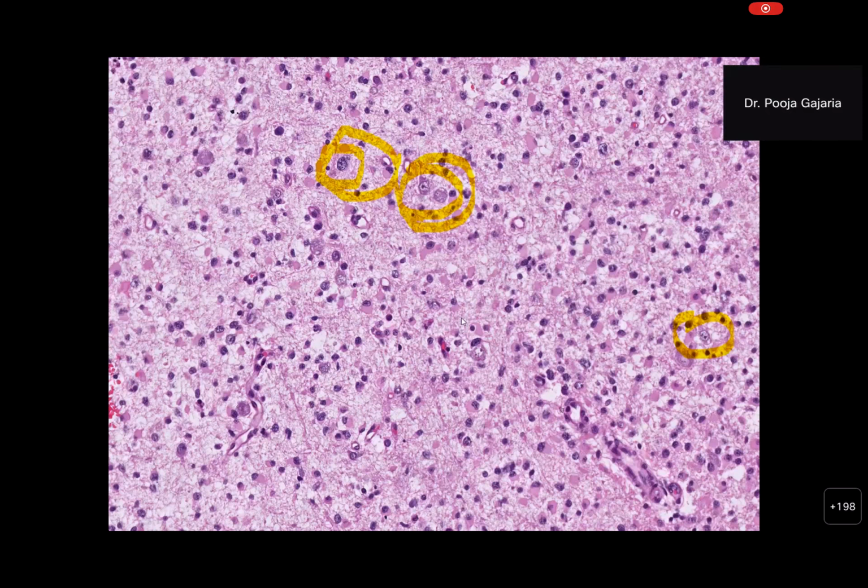So in case of neuro-oncology, anaplasia is a word which is a conglomeration. It encompasses pleomorphism, anisokaryosis, nuclear irregularity, chromasia, all features together. You put a broader term as anaplasia. So what is the next step you want to see after anaplasia and cellularity? You want to comment about mitosis. Did you see any mitosis in this field?